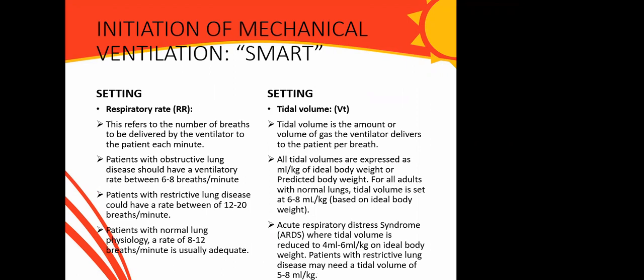There's what we call smart ventilation. SMART is an acronym. S talks about setting, M talks about the mode, A talks about adjuvants, R talks about release or weaning of the patient from ventilator, and T, you need to do troubleshooting of your ventilator, especially when you have some issues.